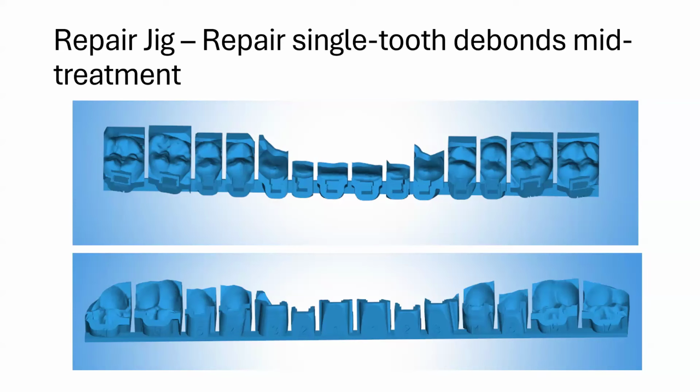It's a good question. It's been remarkably smooth. I think we had a smoother transition than most because we'd already been indirect bonding for so long. Just switching from a tray made out of hot glue to a 3D printed rubber tray was not that big of a transition for us. Our team loves indirect bonding. They like the empowerment that it gives them. They like that they're doing something meaningful and delivering care. It's really been a net positive for us.